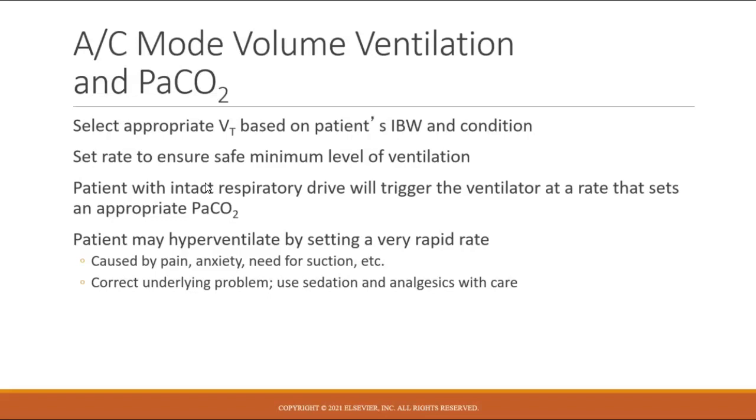You can have patients end up hyperventilating, though, in AC mode more so than even SIMV, because every single time the patient triggers a ventilator, they're going to get a full big breath. So if the patient's in a lot of pain and breathing quickly because of pain, anxiety, or the need to suction, they might have a really fast rate, and that could cause them to hyperventilate easily and drop their CO2 levels.